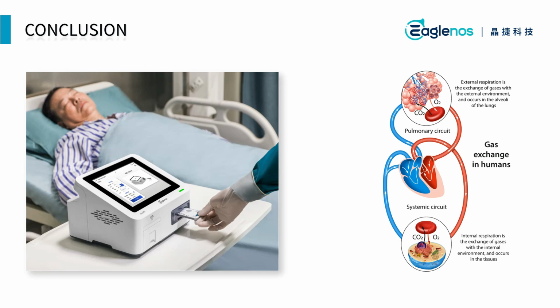In critical conditions such as acute illness, shock, and respiratory failure, blood gas analysis provides valuable information that helps us assess treatment efficacy and adjust therapy. Finally, we reviewed the critical role of hemoglobin and hematocrit in blood management. Through these clinical applications, we can see that blood gas analysis is not just a diagnostic tool, but a crucial component in ensuring optimal patient treatment and management.